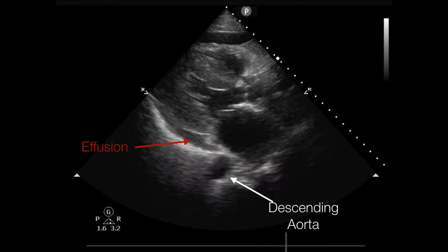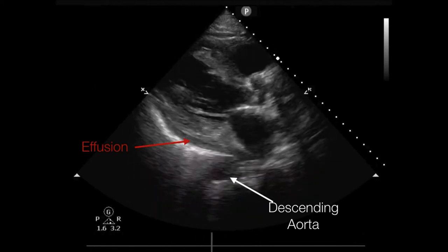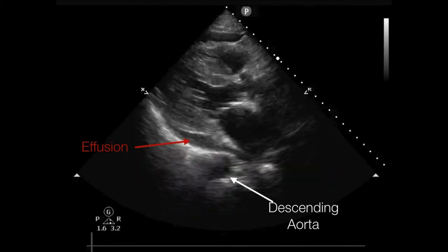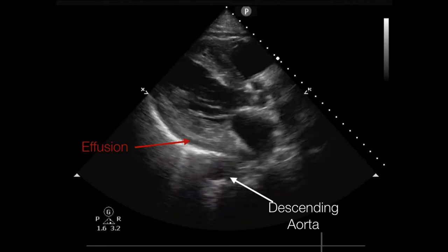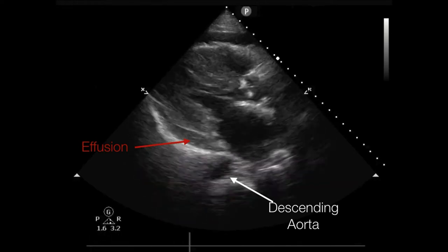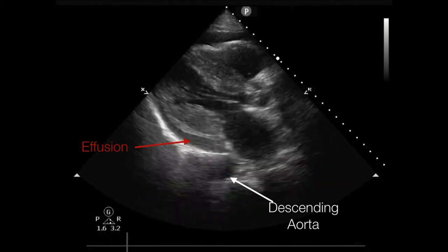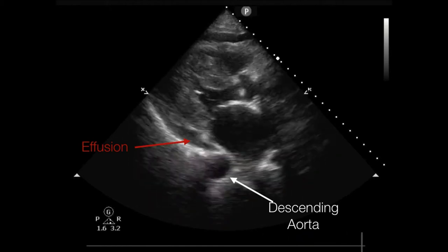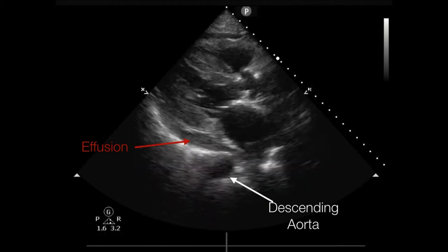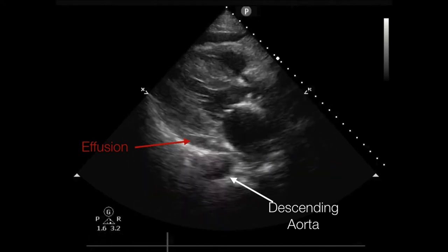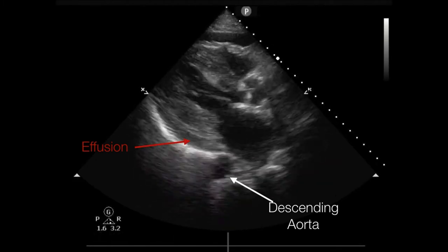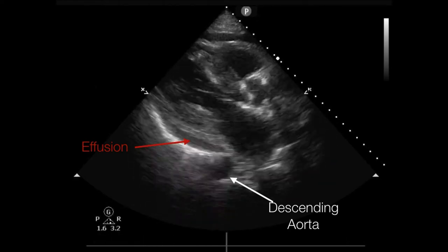So if you see an effusion tracking anterior to the descending thoracic aorta, that's a pericardial effusion. Contrast that with a pleural effusion, which comes up to the thoracic aorta and stops, going down behind it. When effusions get large enough they track all the way around the heart. Small effusions collect in a gravity-dependent area — in a supine patient, deep on screen — and as they get larger they collect anteriorly as well, unless there's a loculated pericardial space.